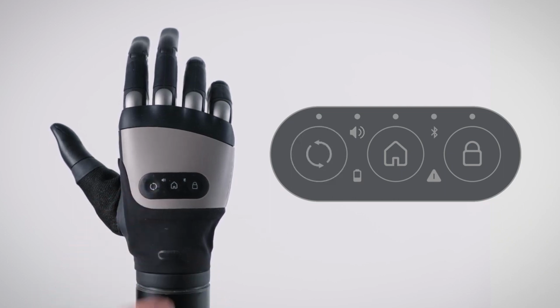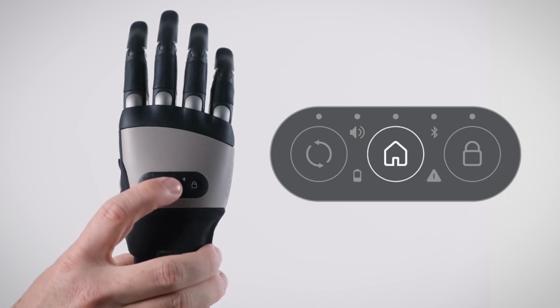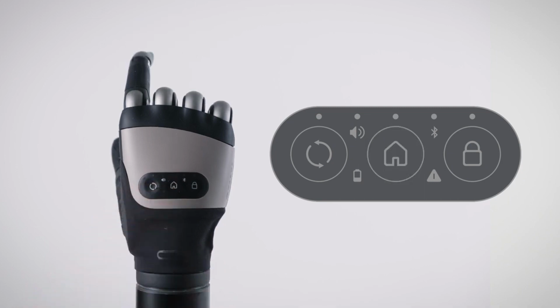A short press on the home button will return the hand to its home grip. By default, this is the general grasp. A long press will return the hand to its second home grip. By default, this is the pincer grip.